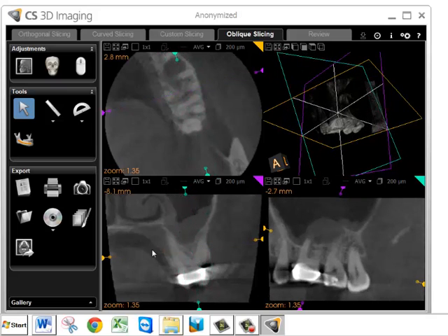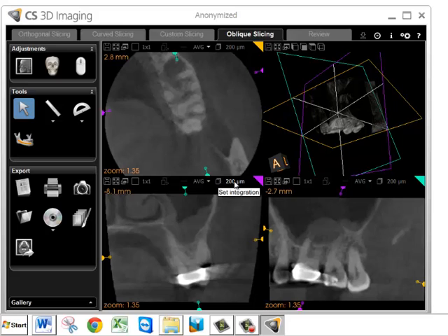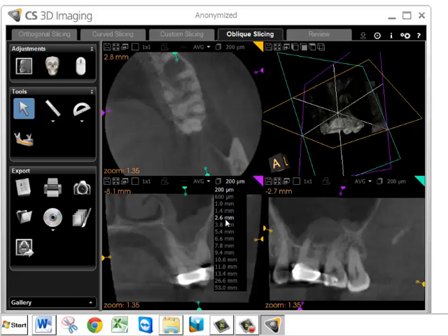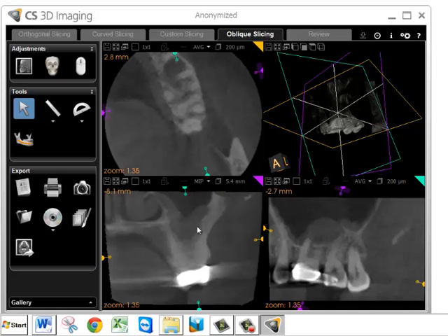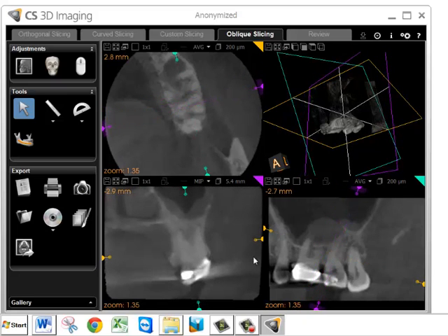In addition to changing the angle and position of the slices, you can also change the thickness of the slice. You'll notice here that there is a 200 micron setting — that's the width of the slice. You can change that to a millimeter or increase the width to 5.4 millimeters. There are two different types of view: the average and the MIP. By changing from one to the other, especially when thickening the slice, the MIP is usually a little better at viewing the information on the slice.